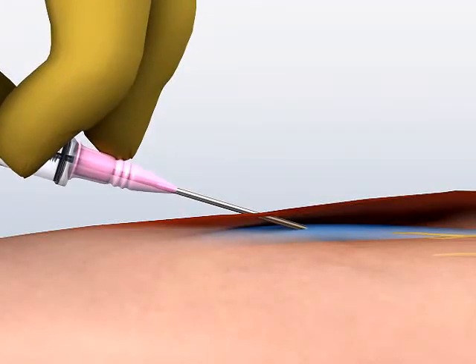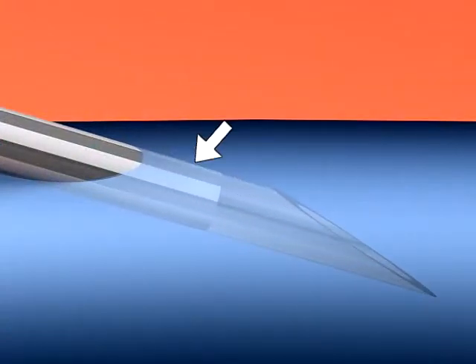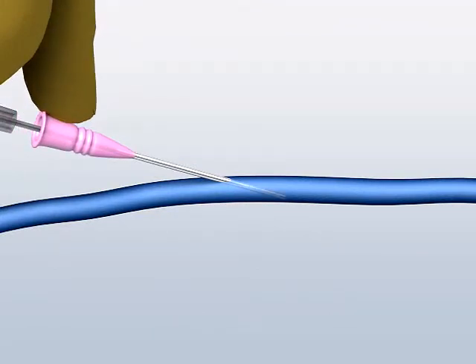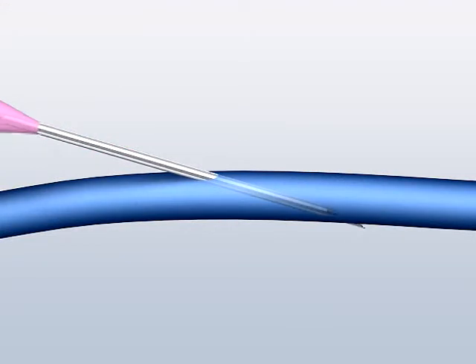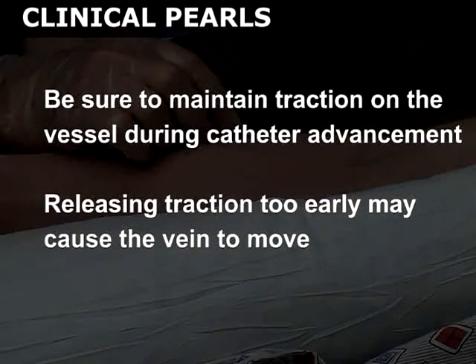Lower the angle of the needle to less than 15 degrees so that the catheter is as parallel to the vessel as possible. Then, advance the entire catheter assembly 1–2 mm to assure that the catheter tip, as well as the needle tip, is in the vessel lumen. Use the index finger of your dominant hand to advance the catheter over the needle and into the vessel. Do not advance the needle along with the catheter, as this may lead to puncture of the back wall of the vein and subsequent infiltration. Be sure to maintain traction on the vessel with your non-dominant hand during catheter advancement. Releasing the traction too early may cause the vein to move, resulting in unsuccessful venipuncture.